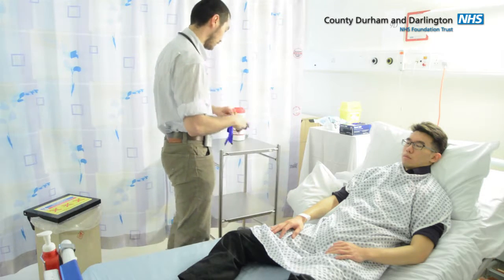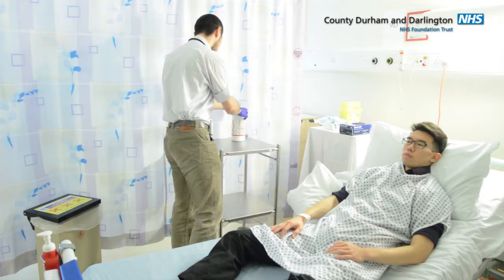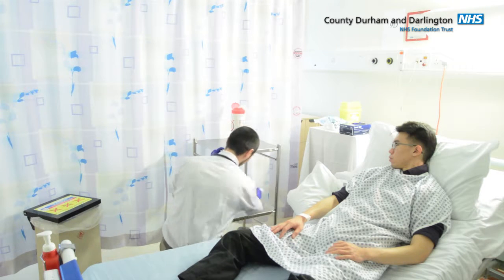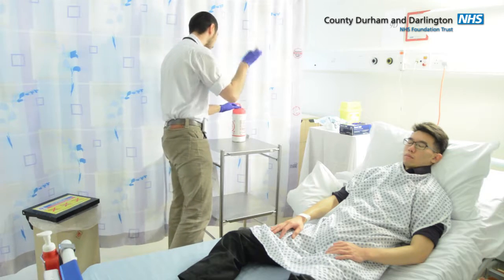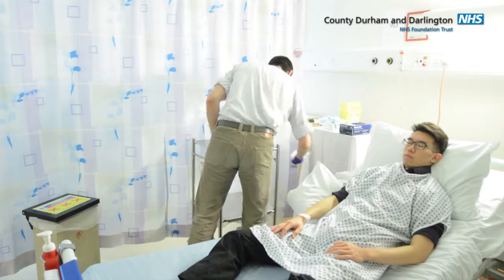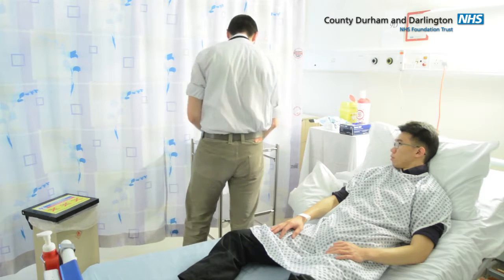After formally checking the identity of the patient, you need to gather your equipment by first getting an aseptic trolley from the treatment room. Put a pair of ordinary gloves on and clean the trolley using a red top wipe. First on the bottom, then a separate wipe for the top.